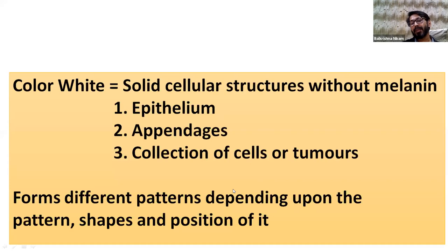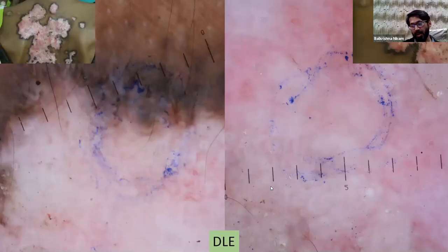These form different patterns depending upon their pattern, shapes, and position in the dermis. Similar to the DLE, I think I have taken much of the time. Samipa, I should finish it here.